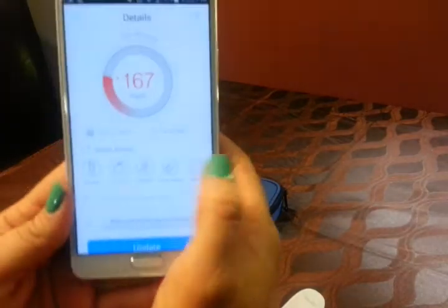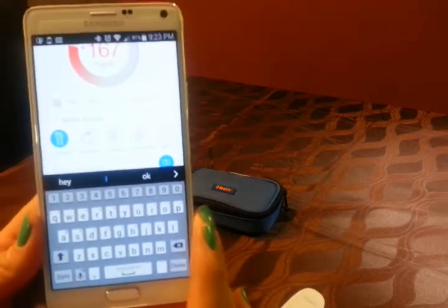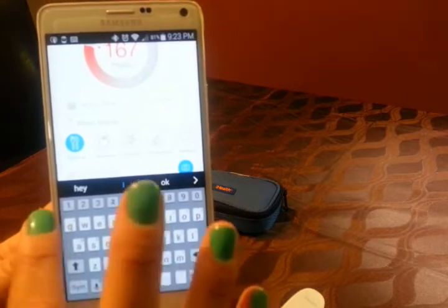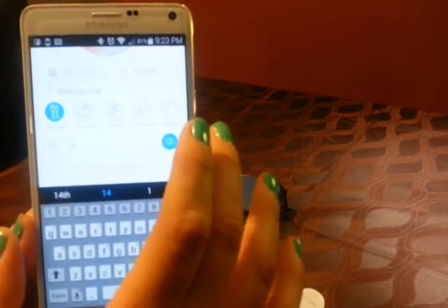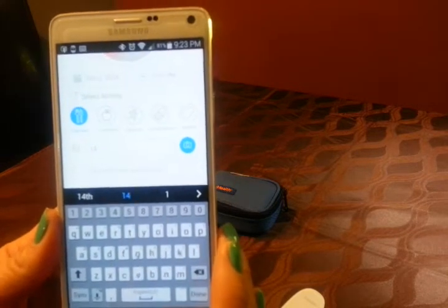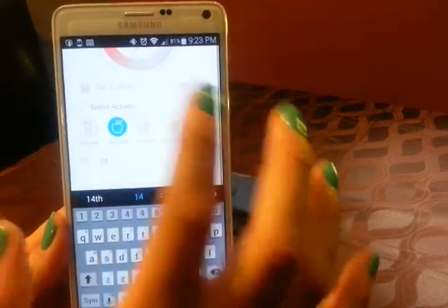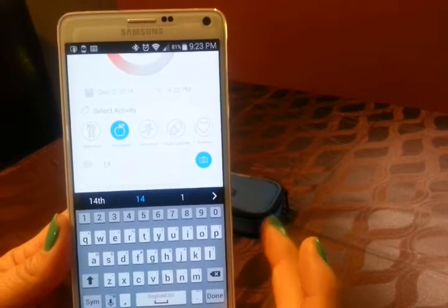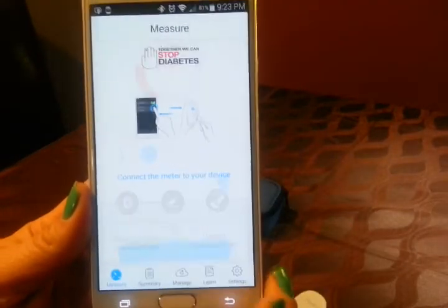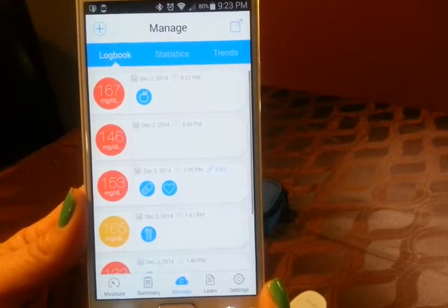So we can add if we just had a meal. I just had some sliced peaches from a can, and it said half the can was 14 grams of carbs, so I'm going to put 14. I did not take any insulin for that, which I will probably do in a moment. Oh look — it says meal, actually — go ahead, snack. Oh, you can even take a picture of it, I didn't even notice that before. Cool. So you can add some notes, press update, go to your summary, and it goes to manage.